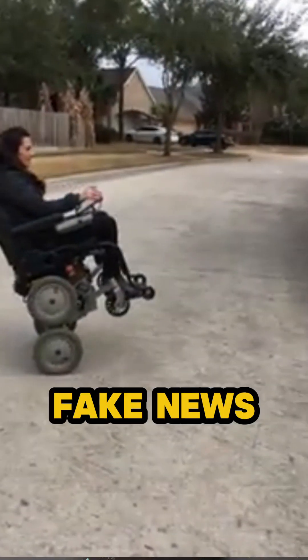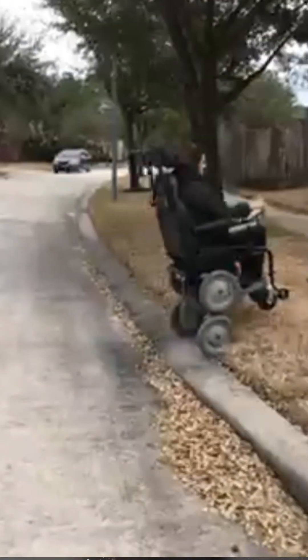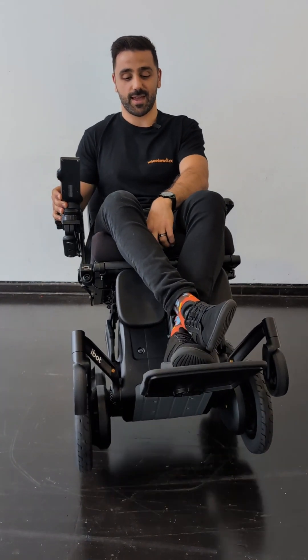This is a chair that I saw on the internet years ago and to be honest, I thought it was a fake chair — I thought there's no way this is actually a real chair and it actually works. But here I am in Germany and I get the opportunity to see it live for the first time. Check this out.